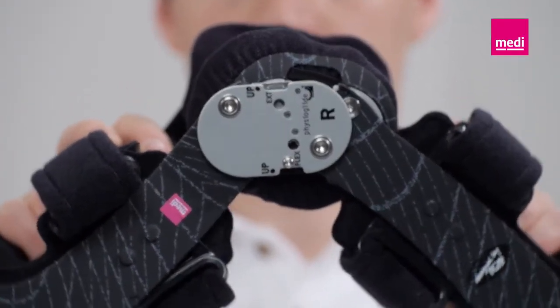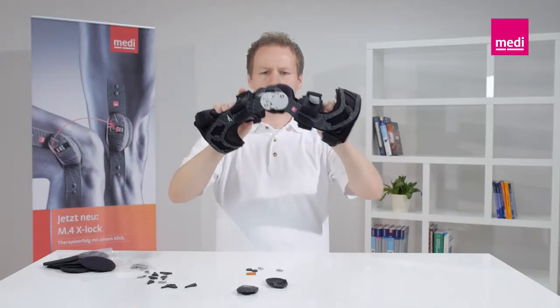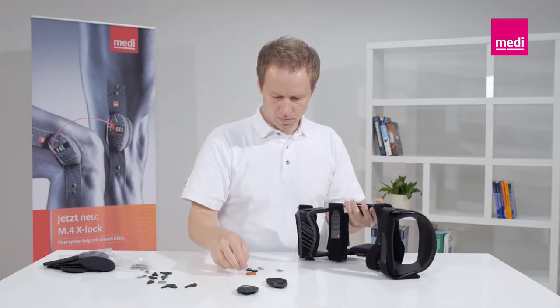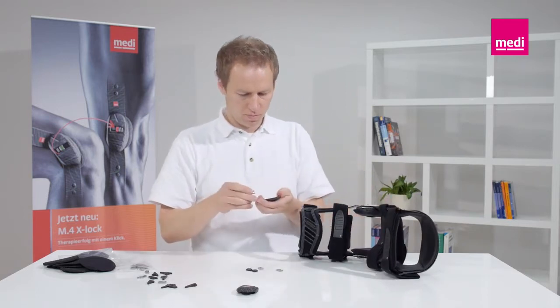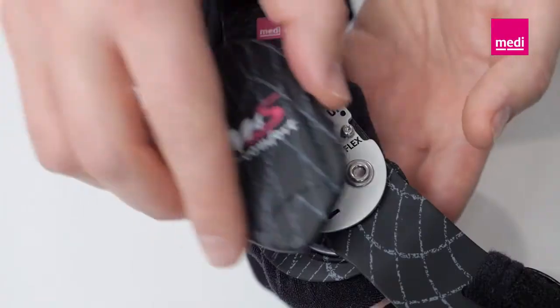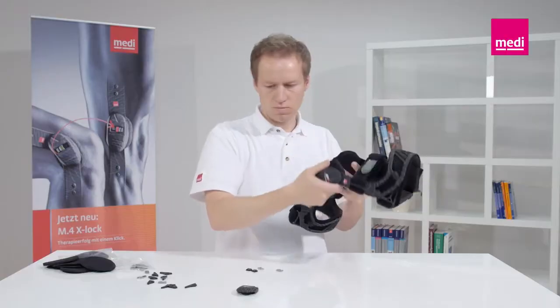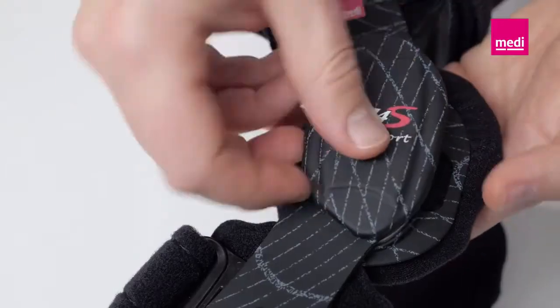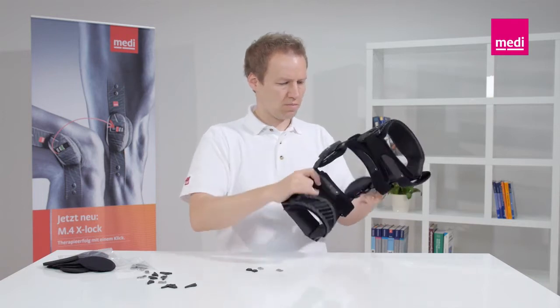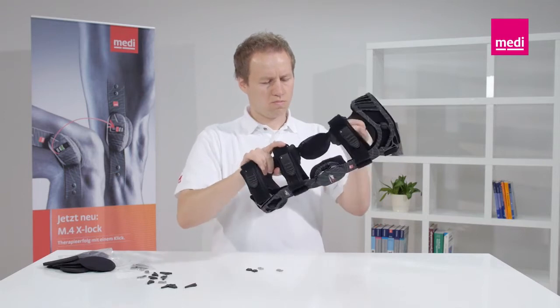Now move the orthosis hinges and check the right position. Click the tweezers back into their holder and then secure the hinge covers by hooking the two tabs on the hinge cover into the front of the hinge and then pressing the cover onto the hinge. An audible click confirms it fits securely. Then move the hinge of the orthosis and check that it functions properly.